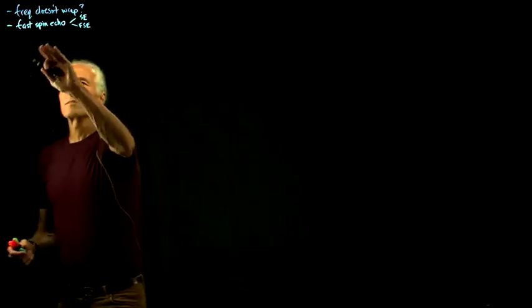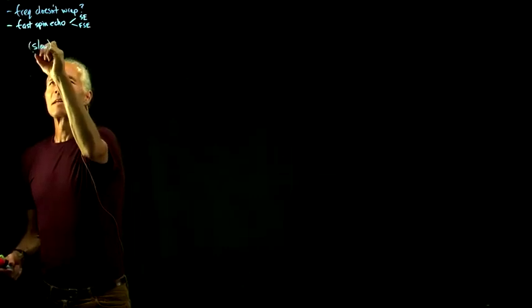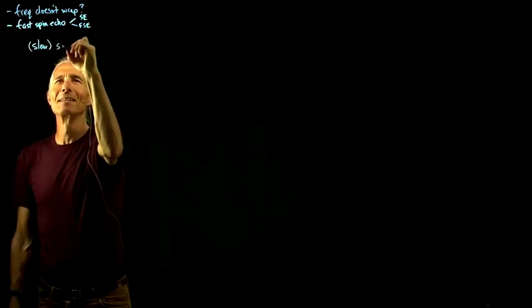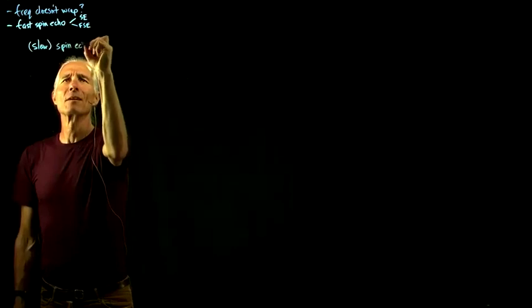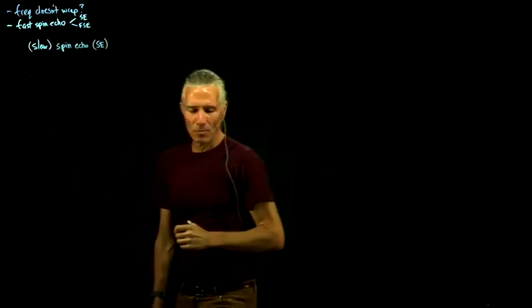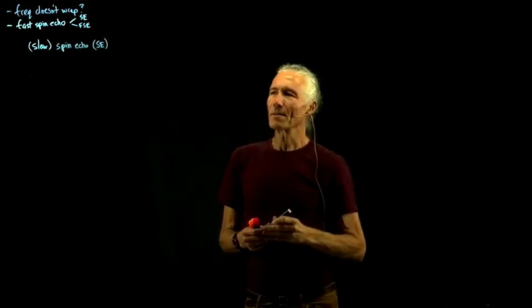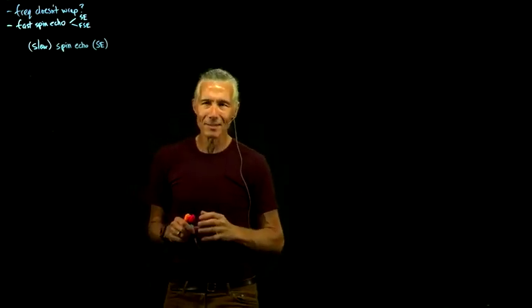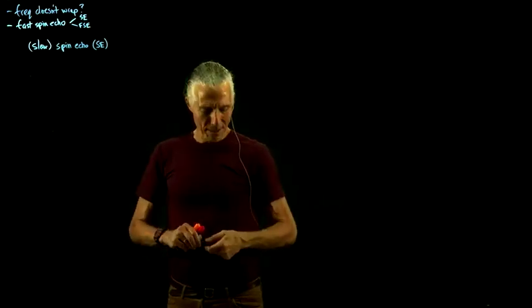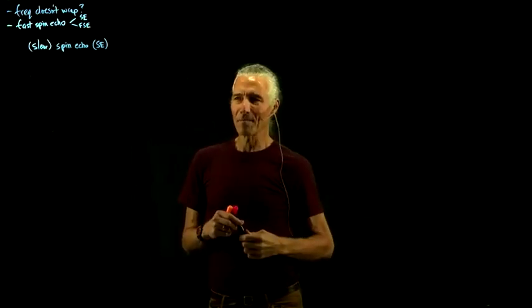And so we'll start off with spin echo, which we can call, I'm old enough that I actually sat in the scanner for some real slow spin echo. So slow spin echo is generally just called SE for spin echo. And I'll write out the sequence for slow spin echo so you can see. Slow spin echo is like the morally upstanding spin echo. It's sort of good spin echo. It doesn't have any weird artifacts associated with it, but it takes a really long time. So to scan your whole brain might take like 45 minutes just for one scan.